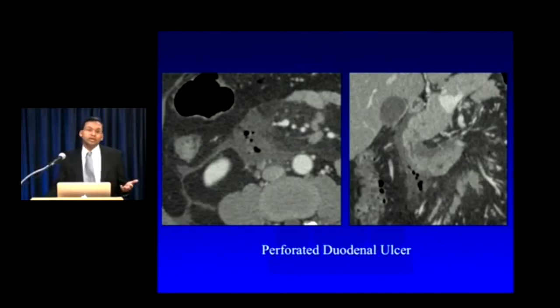This is a perforated duodenal ulcer. And if you just kind of said this was acute pancreatitis without thinking a little hard, you potentially would have given this patient a completely incorrect treatment.